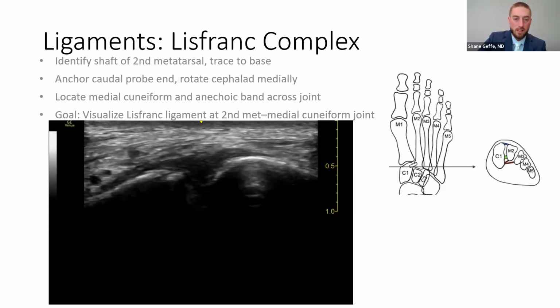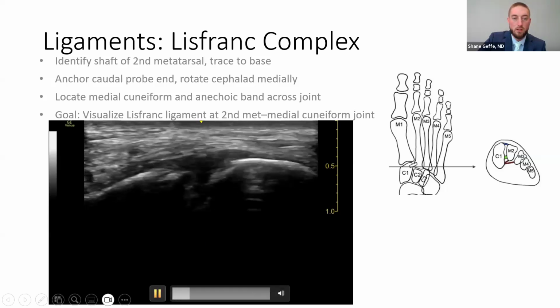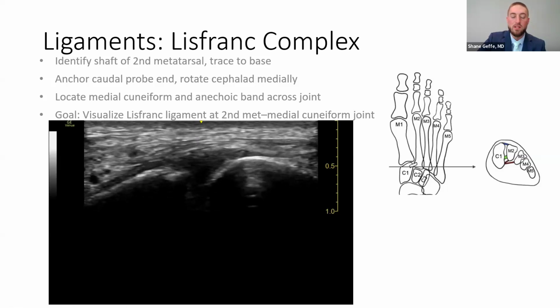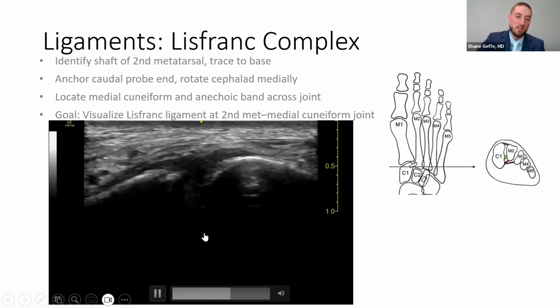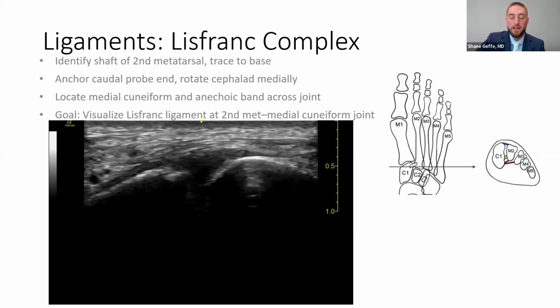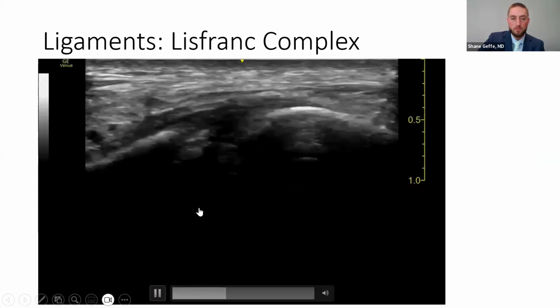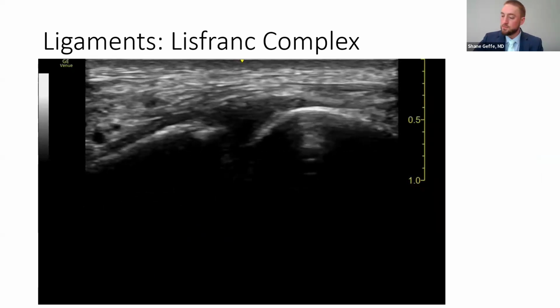But there you go with the scanning, and this is translation. That's the movement that the probe is doing here. I'm just gently translating back and forth. It's a very small ligament, a very fine structure. I used a high frequency probe for this, so it has a very small footprint. I was just trying to convince myself that there was ligamentous tissue there, and I can never see it. A little bit more blown up view here.